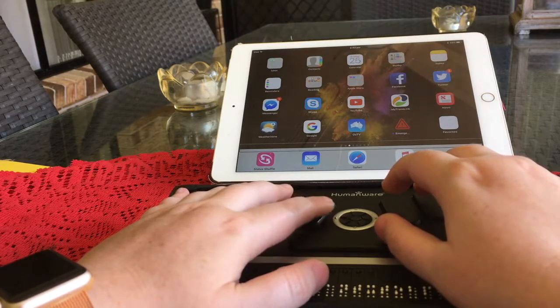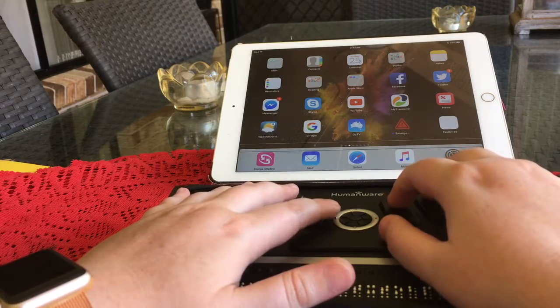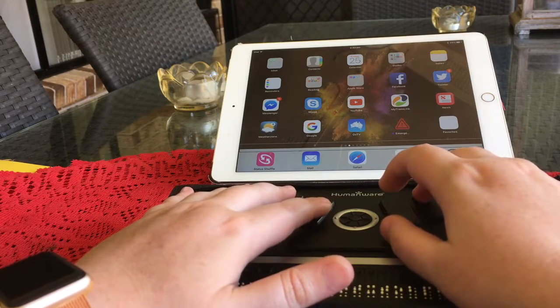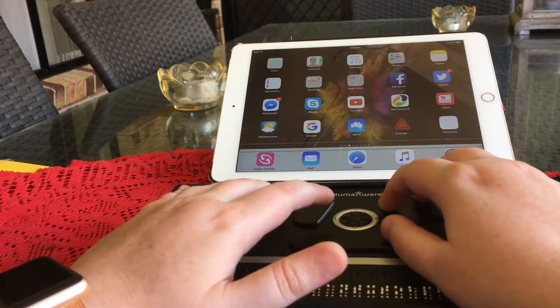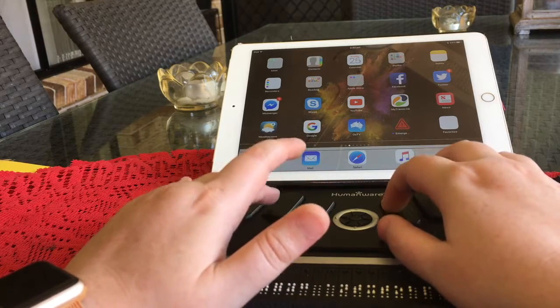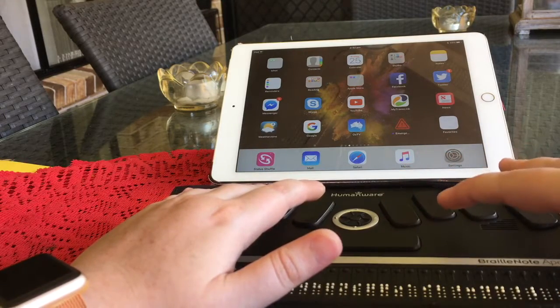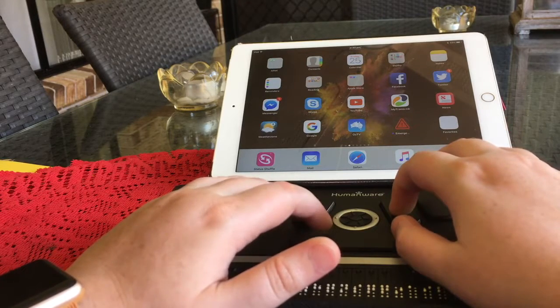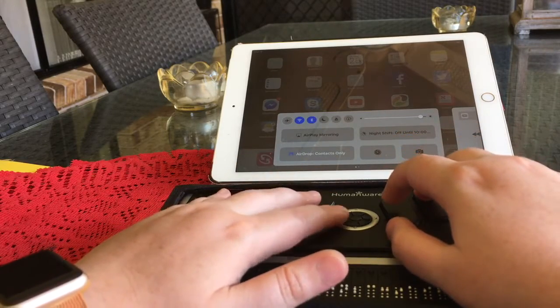I'm just thinking — did I forget anything else? I think that's the basics of navigating around. Of course, to make it read, you can press Space with R to read from current focus, and Space with W is read from top — I might have gotten that slightly backwards, but that's the gist. Space with S will take you to the status bar. Space with middle C takes you to the Control Center.